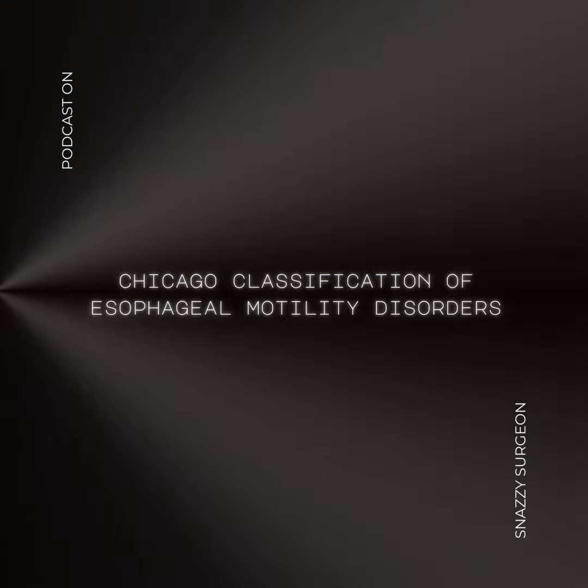This one used to have some colorful names like nutcracker esophagus or even jackhammer esophagus, which kind of give you a picture of how forceful these contractions can be. Hypercontractile esophagus, so even more forceful contractions than in DES. What kind of findings do we see on HRM in these cases? For this diagnosis, the patient usually reports chest pain. And then on the HRM, we need to see at least 2 swallows with a really high distal contractile integral, over 8,000 mmHg·s·cm. And these contractions can show up as single peaks or multiple peaks on the pressure tracing. But the important thing is the lower esophageal sphincter pressure, that's usually normal, and it relaxes fine with each swallow. Wow, a DCI over 8,000. That sounds like the esophagus is going into overdrive.